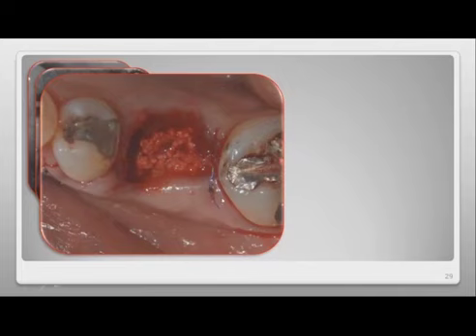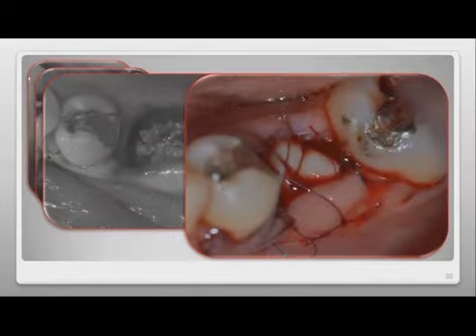Without the primary closure, we can observe the first sutures on the lesion. Without this primary closure, without a graft of course, the healing of this site would be even more complicated, so we use a graft at this time of surgery. The patient's agreement is required after explaining the causes. We take a connective tissue graft from the palate, which will simply and easily constitute a membrane to cover this alveolus that cannot be closed for first-line therapy. In this way, we are assured of the most suitable healing possible for prosthetic or implant purposes. We also prevent collapse in this area, which would complicate the treatment or replacement of the tooth.